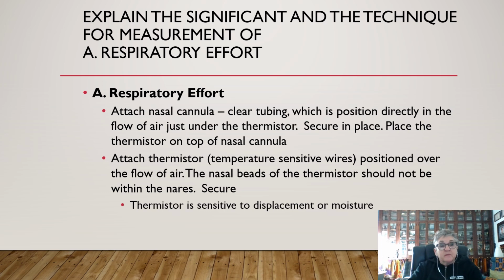Attach the thermistor, the temperature-sensitive wires. They're positioned over the flow of air. The nasal beads of the thermistor should not be within the nares, and then secure. The thermistor is sensitive to displacement or to moisture.